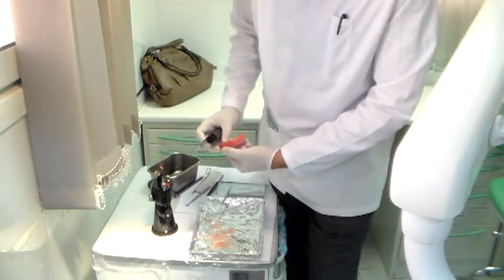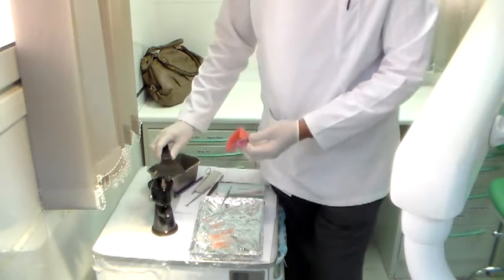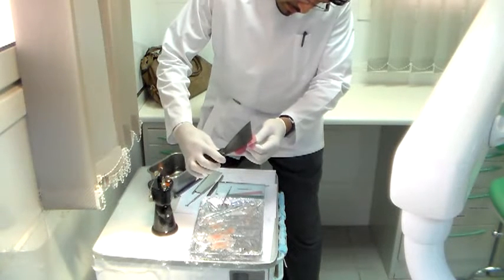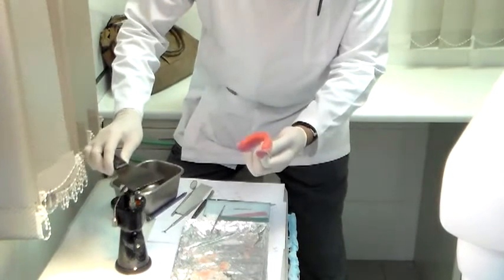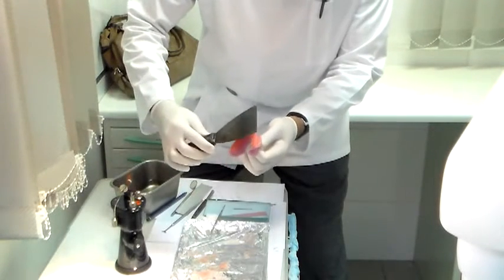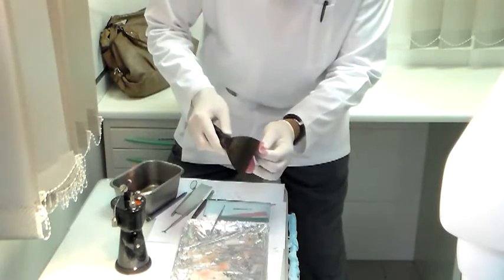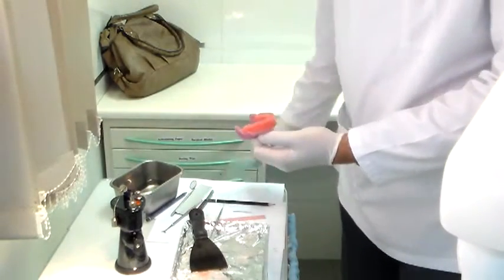As I reduce, I will touch this first, wait till it touches here, and I will stop. Once it touches, I stop, and I want to check my plane.